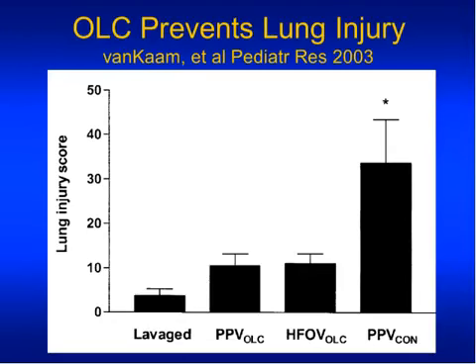We also recognized that we were ventilating these babies with tidal volumes that were no larger than the dead space volume that we estimated and measured. And it turns out that we, in fact, do ventilate babies with tidal volumes that are no larger than dead space. So here we have the standard respiratory physiology that you're all familiar with. In the left-hand panel, we have the standard little boxes moving in.